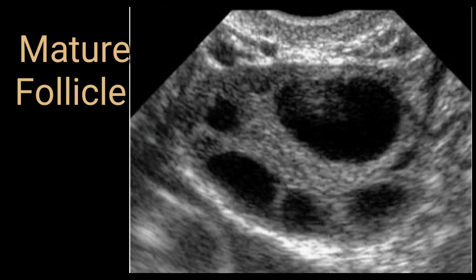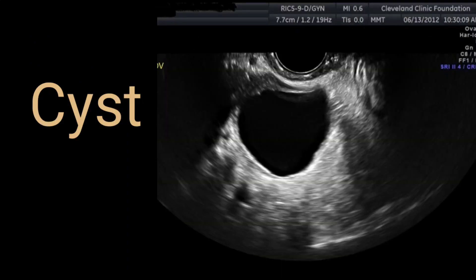On this image you can appreciate a frank cyst measuring 3.3 by 3.5 centimeters — this is a simple cyst. You can confidently mention on your report that the right or left ovary shows a simple cyst with the measured dimensions. Also mention that a follow-up scan is advised within six to eight weeks, as the cyst is likely to disappear or regress. If it still persists, refer the patient to the gynae unit.